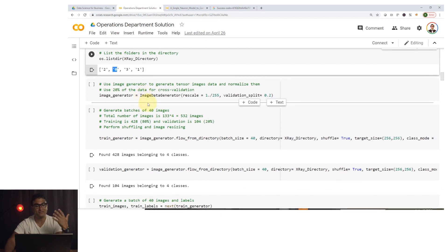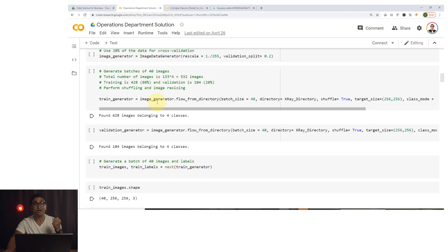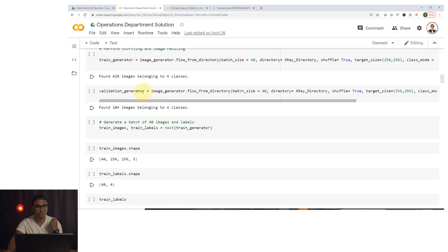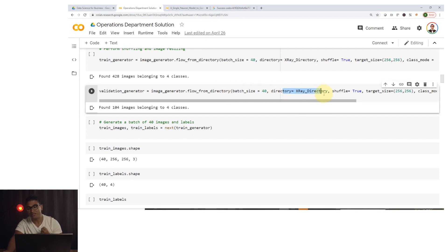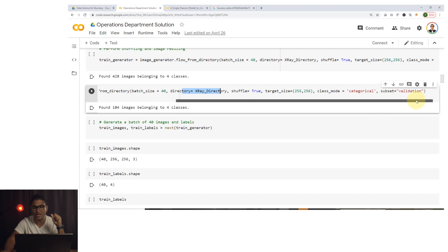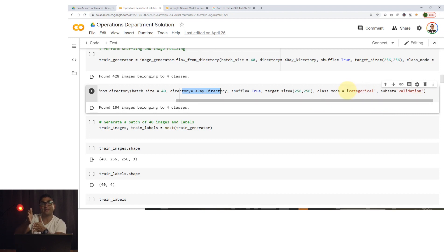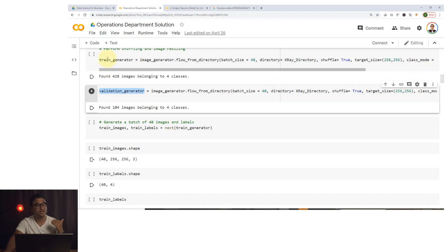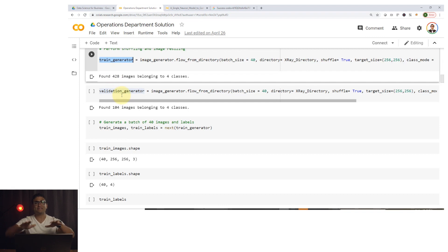We're going to use an image data generator to generate and resize batches of images. We'll use a batch size of 40, point to the x-ray directory, shuffle the data so the network doesn't learn any ordering dependency, and set the target size to 256 by 256 pixels. The class mode is categorical for multi-class classification. We'll have a training generator and a validation generator to validate on images the model has never seen during training.